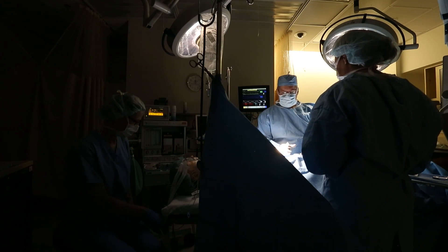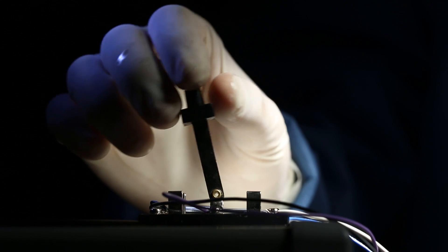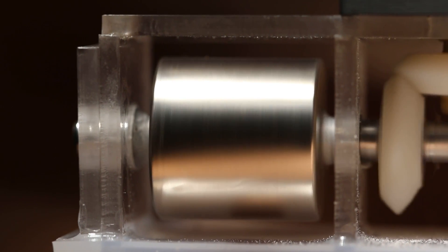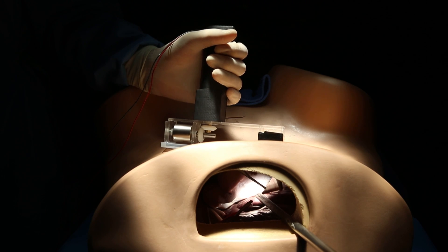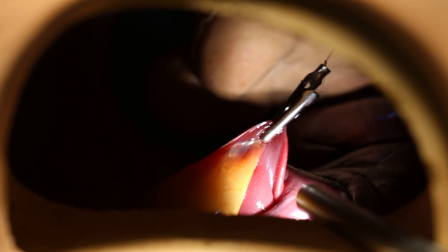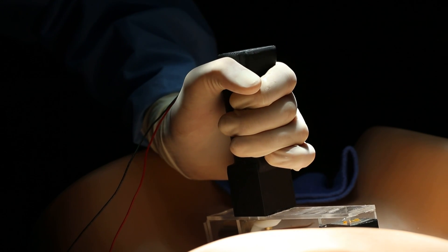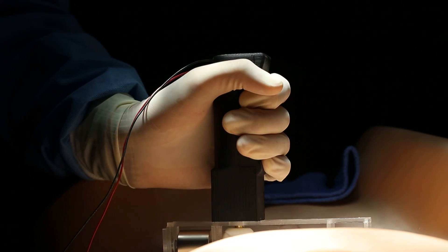The instrument is introduced through a surgical incision and manipulated by the surgeon. Here we see the external unit and the actuation magnet that is spinning. The external handle has the magnets that couple with the internal instrument, and here we see the internal instrument retracting the lobe of the liver to expose the gallbladder. By moving the external handle, we are moving the internal instrument that is coupled magnetically across the abdominal wall.